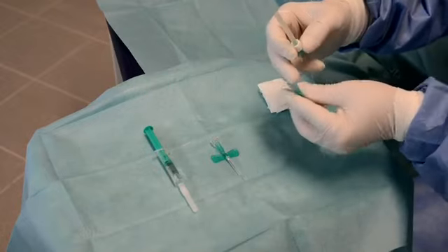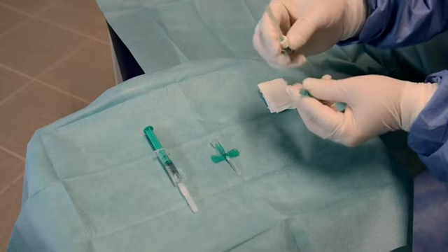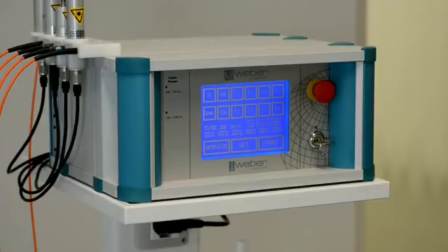So in this laser catheter we will give the light from the device through the fiber optic cables, by fiber coupling into the plastic fiber, and give it directly to the pain or damaged area.